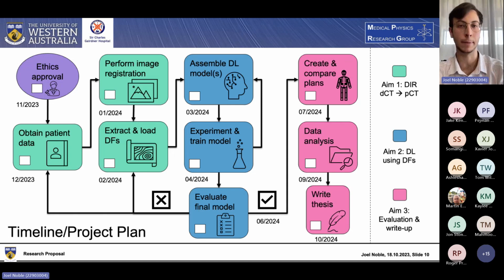Particularly, it'll be interesting to investigate because, as I said, we're mostly looking at correcting for the different couches. So perhaps augmentation wouldn't need to occur across the entire range of the CTs. But I suppose you would want to keep it consistent, and particularly for things such as the spine and the bony regions, you wouldn't be augmenting them to a great deal. But that will be something I'll need to investigate further and wrap my head around. There were some good guidelines put forward by that Deep Perfect paper, which will inform that. But I think a bit of experimentation will be required. If it's needed at all, it may be that the data that can be acquired is already sufficient.